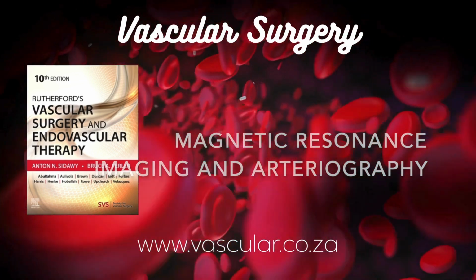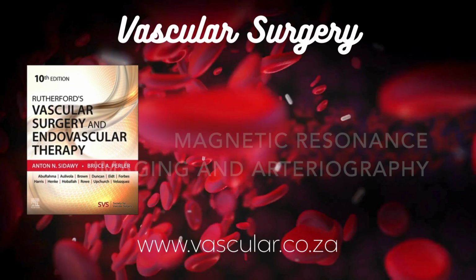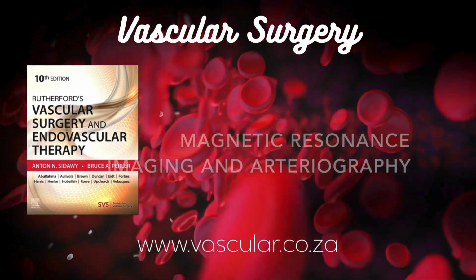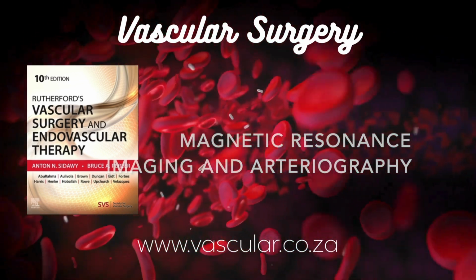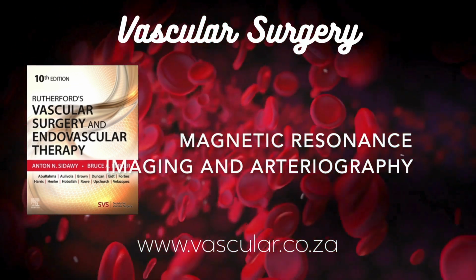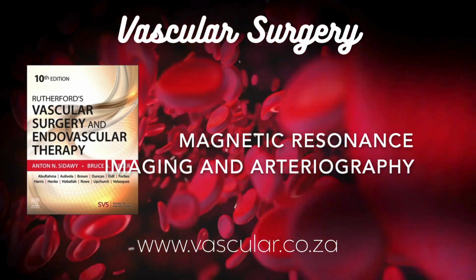A higher matrix size means more pixels in the same area, which translates to higher spatial resolution. That lets us see finer details in the blood vessels. And an MRA is usually 3D. Yes, most modern MRA is done using 3D sequences. So the FOV is a volume, and the matrix defines the size of each tiny 3D cube called a voxel. This 3D data gives us a lot of flexibility later.